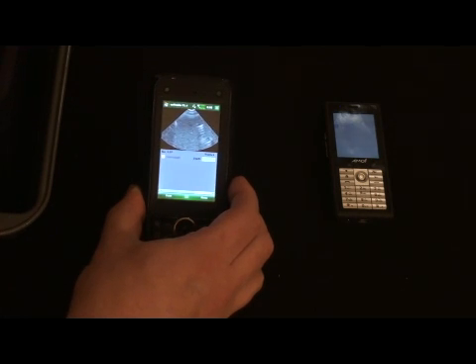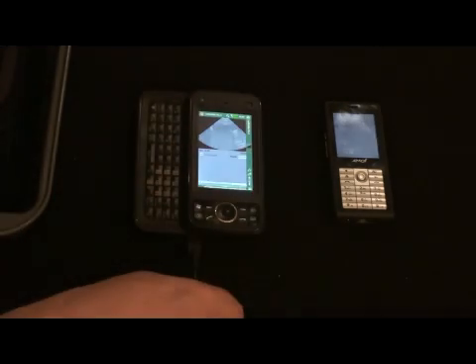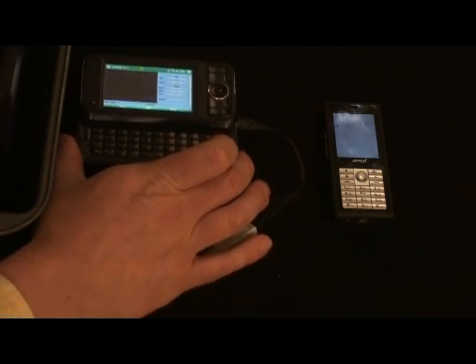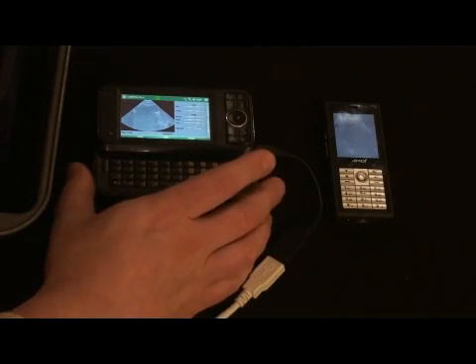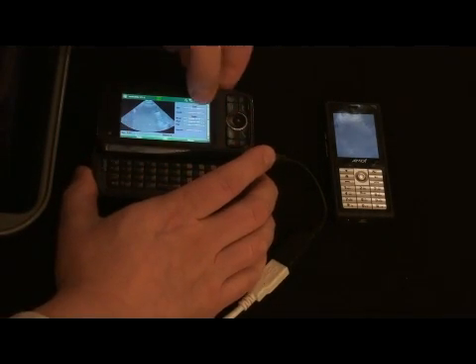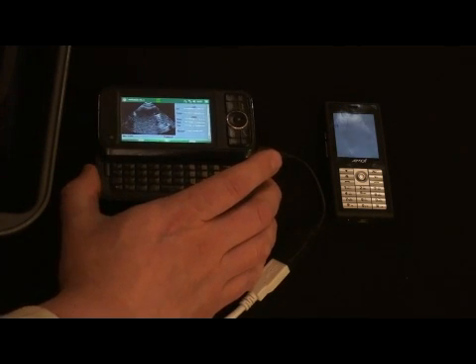I can start and stop the probe by pressing a button that's on the probe. Now you see the image is frozen. We can actually, on this phone, slide out the keyboard. You can see we can turn it sideways now. Once it's in sideways mode, it's going to give us a little bit of contrast, so it'll be a little bit easier for us to see the image.